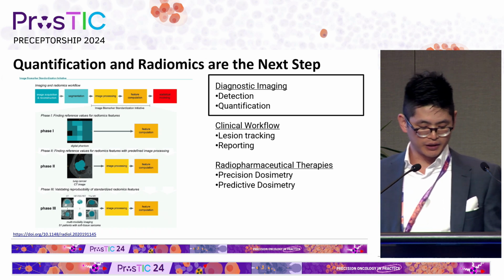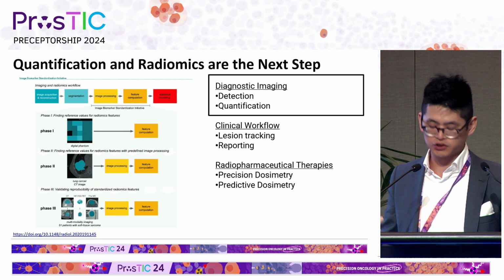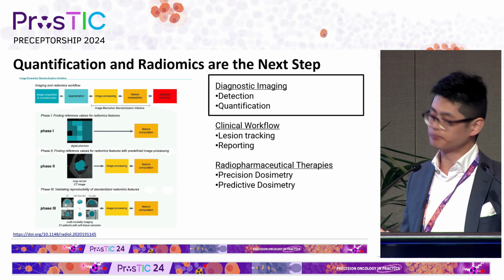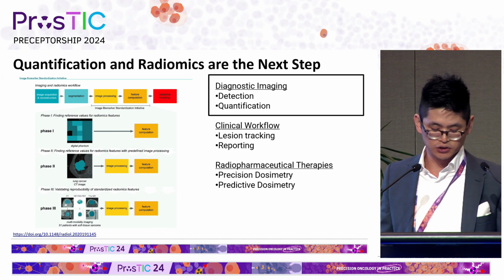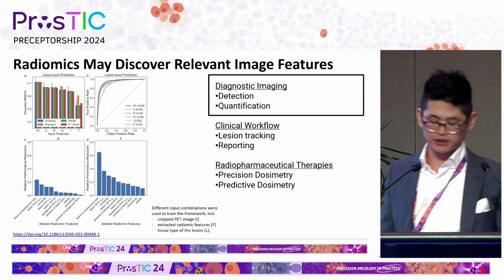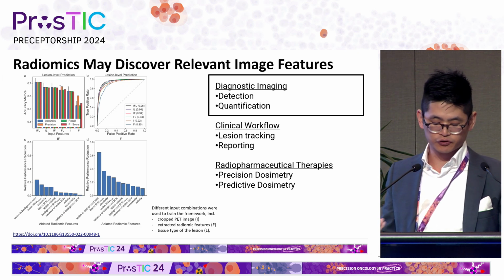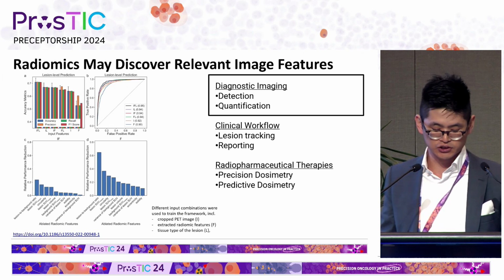And radiomics really is about extracting further quantification features that are beyond the naked eye. And to improve reproducibility, I would at least include the Image Biomarker Standardization Initiative, and that has over 174 radiomic features. So using radiomics may help as a discovery tool for relevant features, and it can be useful to assist with deep learning AI explainability via ablation studies.